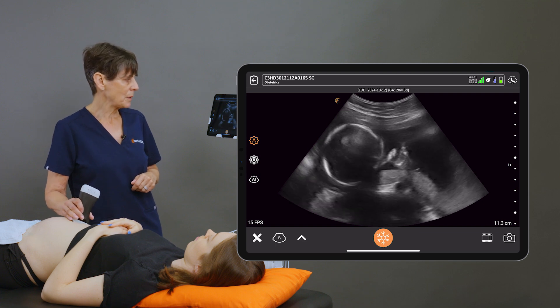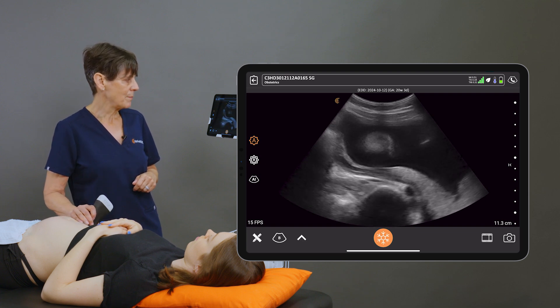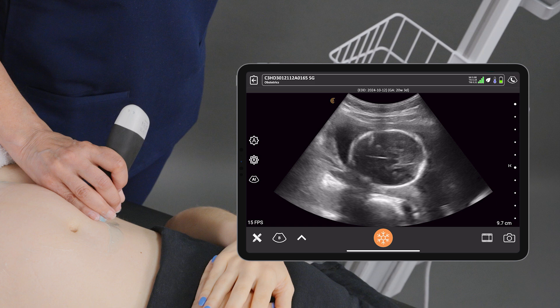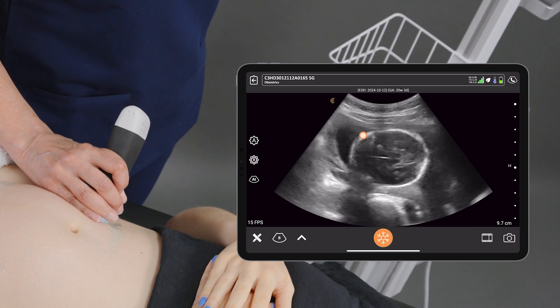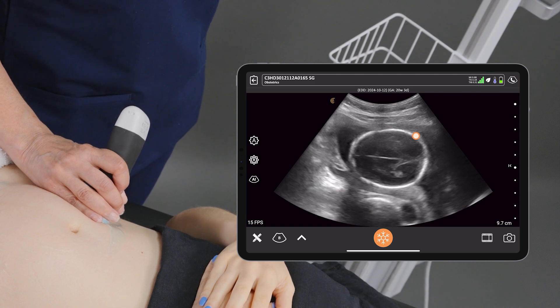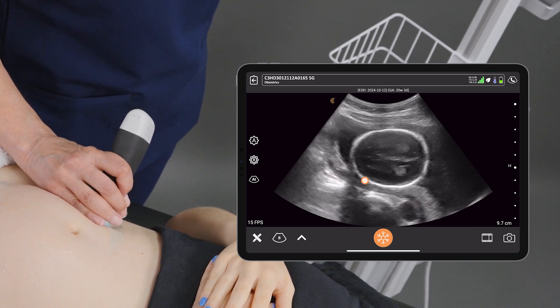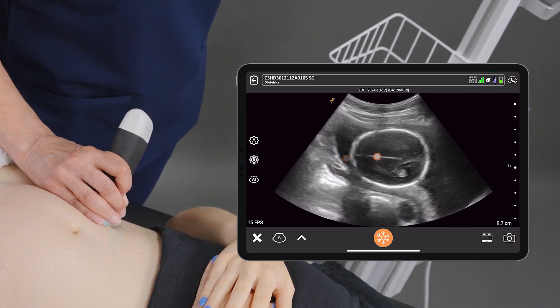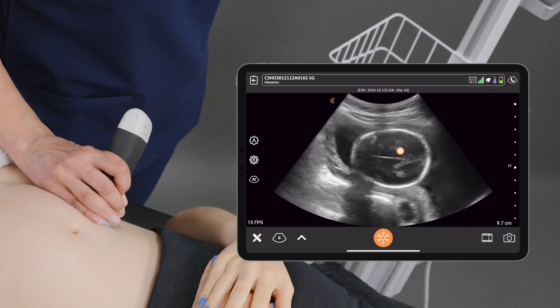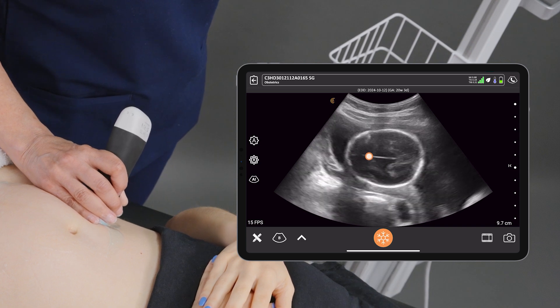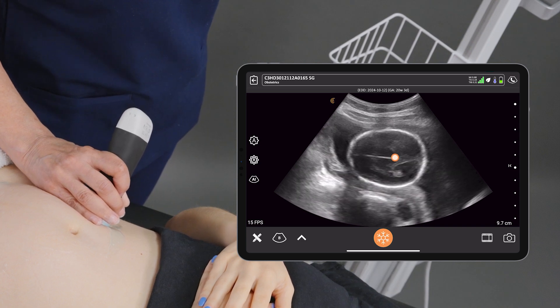We'll locate the baby's head. What I want is a cross-sectional slice through the baby's head just above the level of the ears, and it's important that we see the thalami in this view. We also want to see the midline centered — we don't want to be rotated.